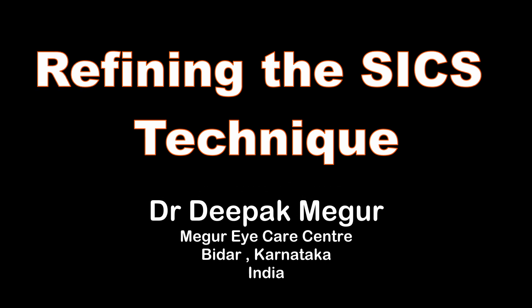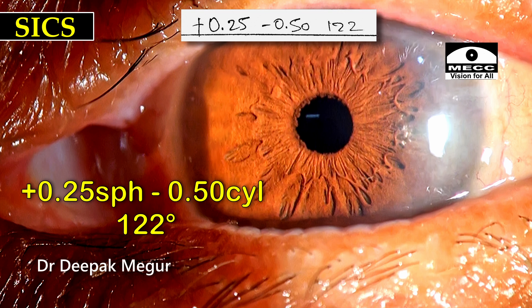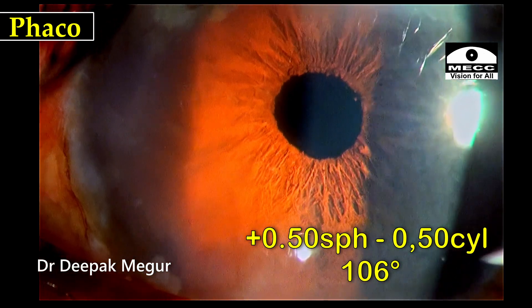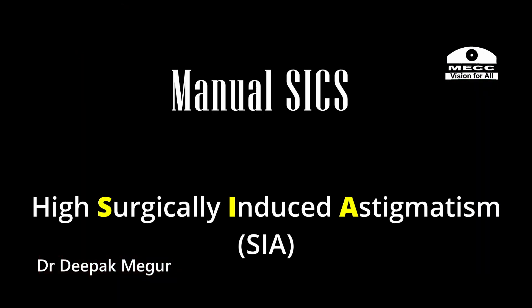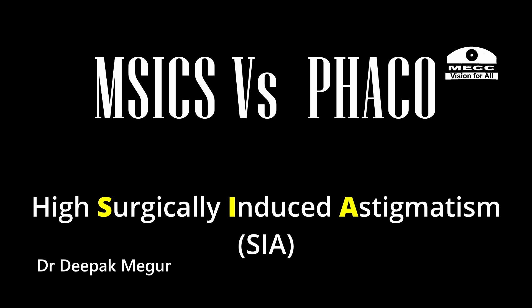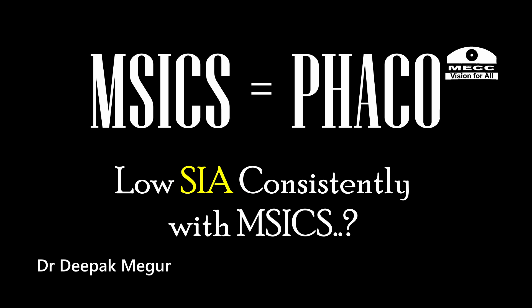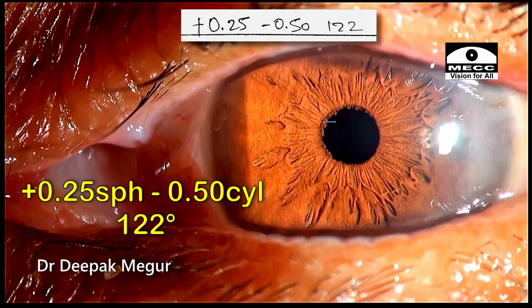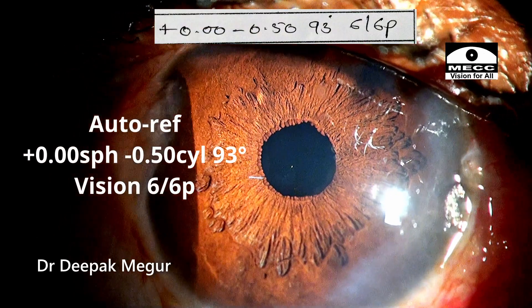Hello. How can we ensure that the post-operative refractive outcomes of manual SICS are comparable to that of phacoemulsification? We all know that high surgical induced astigmatism is the single most important disadvantage of manual SICS when pitted against phacoemulsification. Can we achieve a predictable and relatively low surgical induced astigmatism consistently with manual small incision cataract surgery? We should try to achieve a post-operative refraction of 0.5 cylinder or less in most cases.